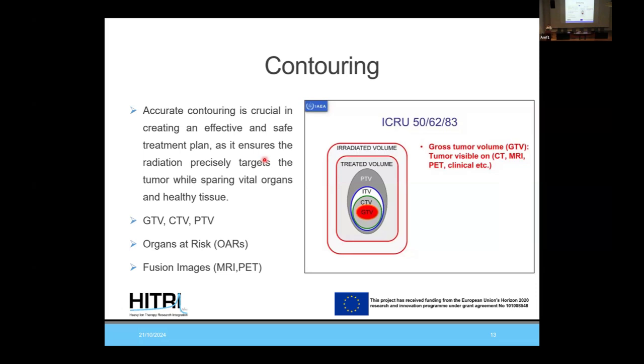For the delineation, it's very useful for the doctor to use MRI and PET. Okay. It's very, very useful. They can define where is the problem. Here comes the physicist who has to fuse the images of the MRI and the PET. It's difficult because many times the images from the MRI or the PET have a different table from the radiotherapy, so the coordinates are all changing.